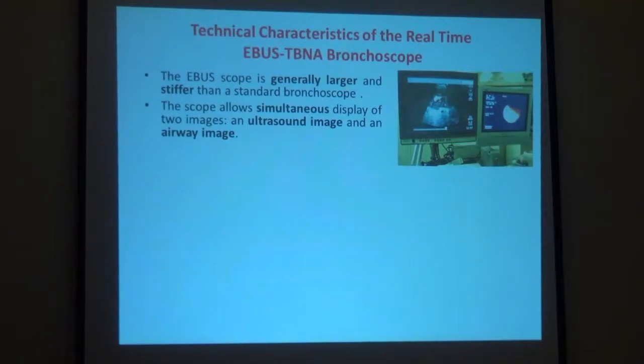مهم جدا إنك تعرف إن الإندوسكوب بيبقى ستيف وأتقل من المنظار. يمكن الواحد أول ما يجي يشتغل بالإيبوس تي بي إن إيه، اللي هو الكونفكس بروب، بتلاقي إيدك بتوجعك لأنه أتقل بكتير من التاني. تاني حاجة المانيبيوليشن، ساعات عشان بتشتغل عن طريق اللارنجيال ماسك بتلاقي فيه صعوبة، وبتحس إن إيدك بتوجعك بعد المنظار لأنه أتقل، وبتحتاج تدكك بإيدك شوية.